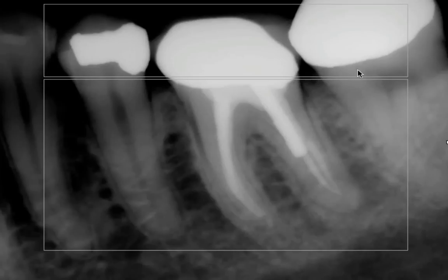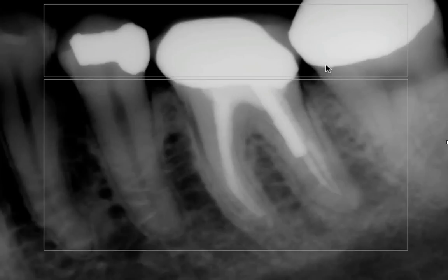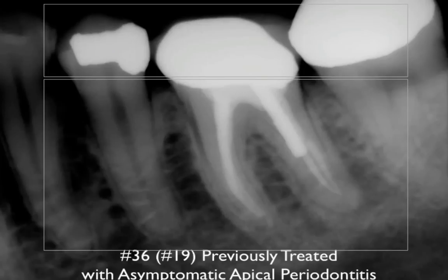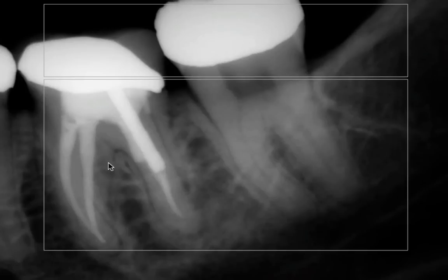We're going to take not only a straight-on radiograph — and this image is particularly around tooth number 36, or universal number 19. As you can see, the diagnosis for this tooth would be: previously treated tooth number 36 or 19, with asymptomatic apical periodontitis. So you get a straight-on, and you also get a shift — whether it be a mesial shift or a distal shift, it doesn't really matter.